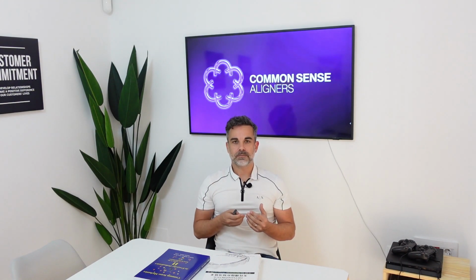So let's imagine I'm having your niece or your nephew in my office tomorrow, and they're like 10 years old, and they have maybe a transversal problem. And I don't know if it's dental or skeletal. And it is clear evidence that with this 3D approach, I'm making a better diagnosis. It is great if I can analyze perfectly what's a transversal problem, and if it's a skeletal problem, I might go for a disjunction instead of dental expansion. And this is quite important.